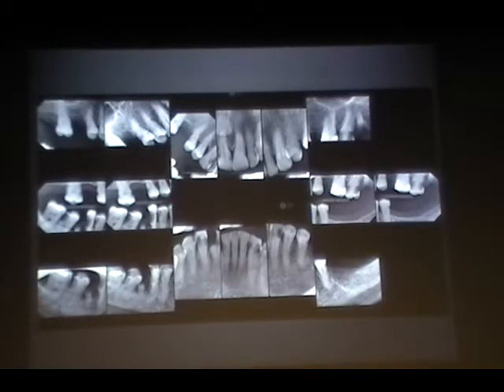What is the term that you use if you make the teeth look smaller? Yes. How about this one? What's your name? Stella. Okay, that's easy. There's an artifact on the top of the image. What do you call that artifact? We use a cone to take X-rays, and if there is a cut, what do you call it? Okay, that's exactly what it is.